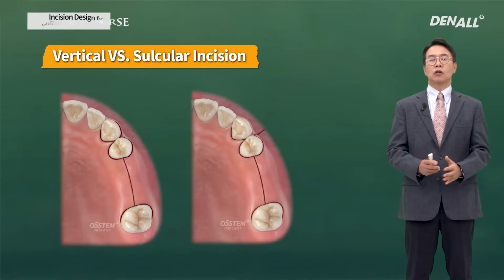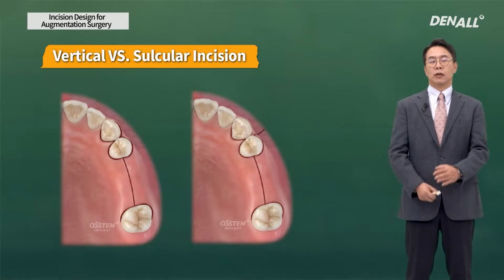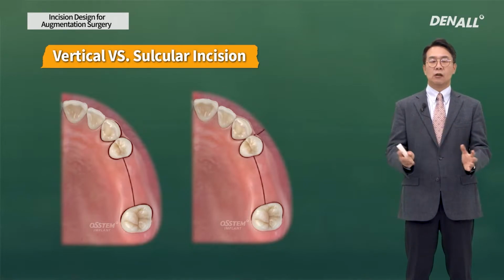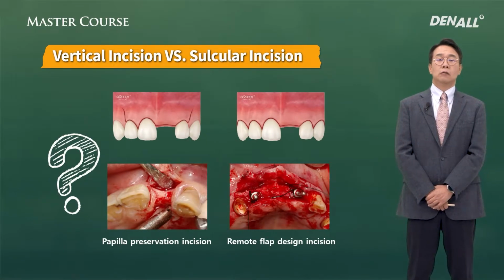Using vertical incisions, we can delineate the surgical field from other areas, and the visibility can be secured. So vertical incisions are required for augmentation procedures.